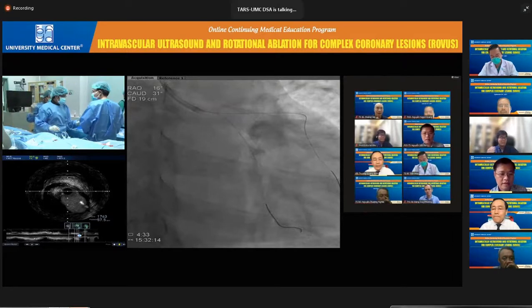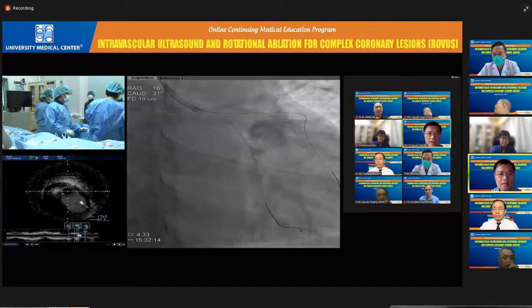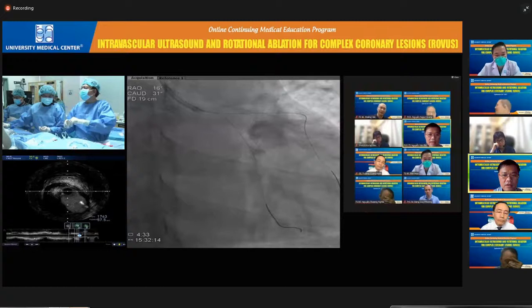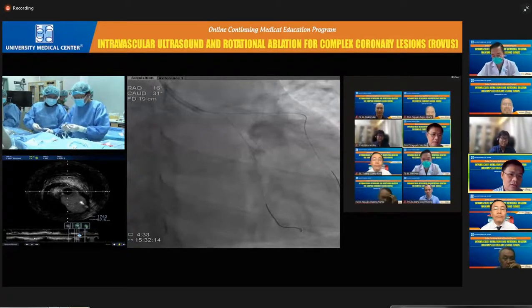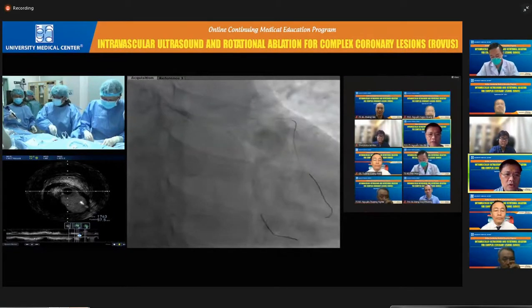Yes. Thank you for your question from Dr. Wu. Usually we have the IVUS measure. So we choose the balloon, the left main to LAD, by the LAD diameter for crush. So depending on the diameter of the proximal LAD, you can choose the balloon. I don't remember exactly the first time you measured the diameter in the proximal LAD. What size was the diameter in proximal LAD? Maybe 3.0 or 3.5 or something.